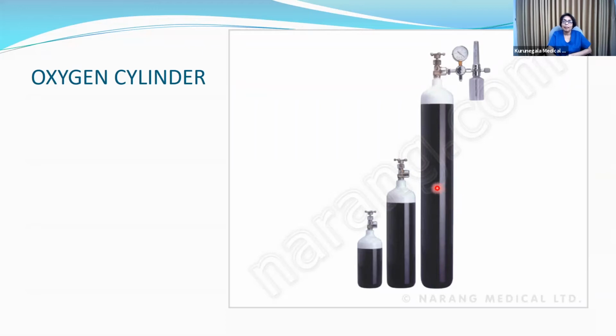It's very important to have an idea about the content of the cylinder, because when you transfer patients, you will have to take an adequate number of cylinders. At the same time, a badly oxygen dependent patient can't have any discontinuation of oxygen therapy. So once one cylinder is over, the next should be ready, otherwise his life will be in danger.